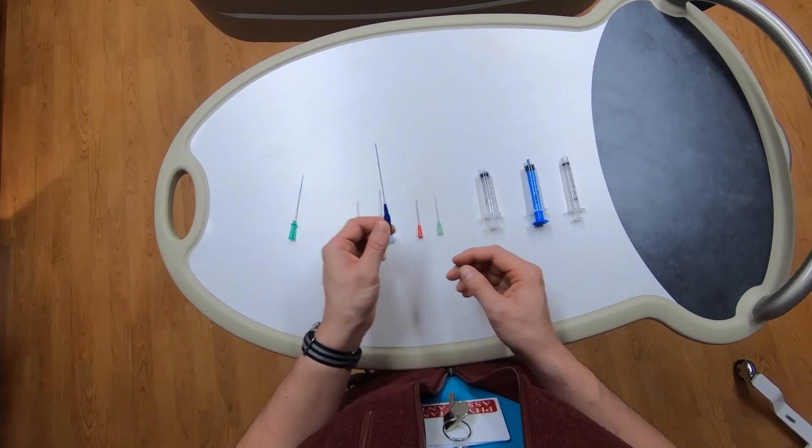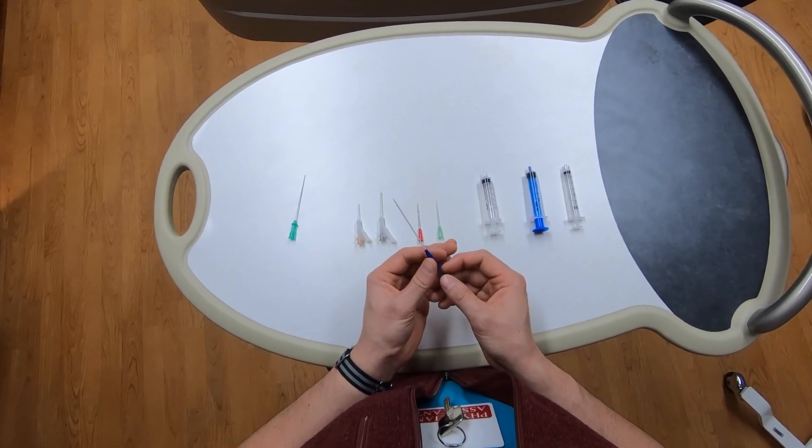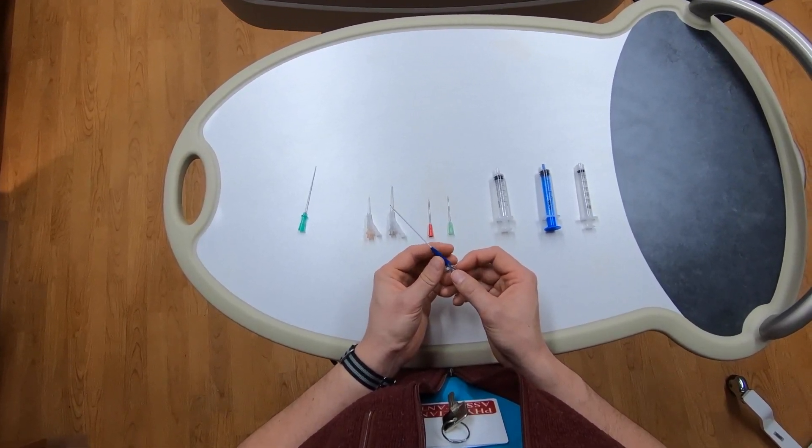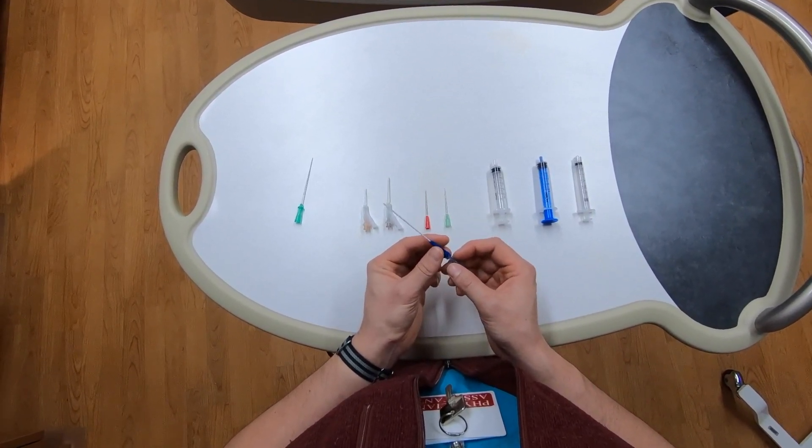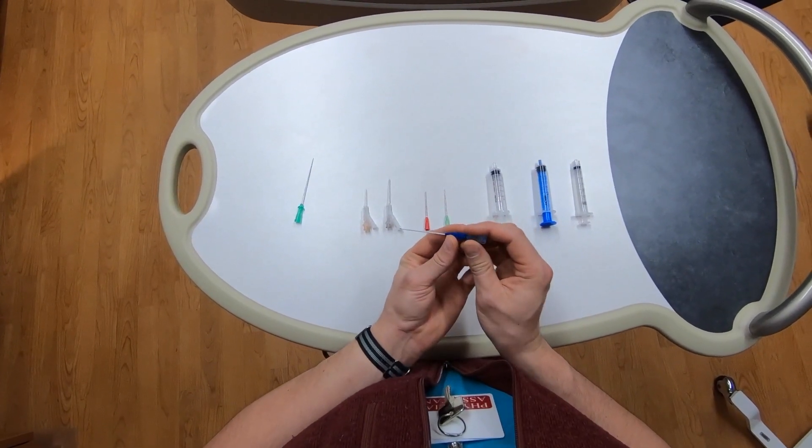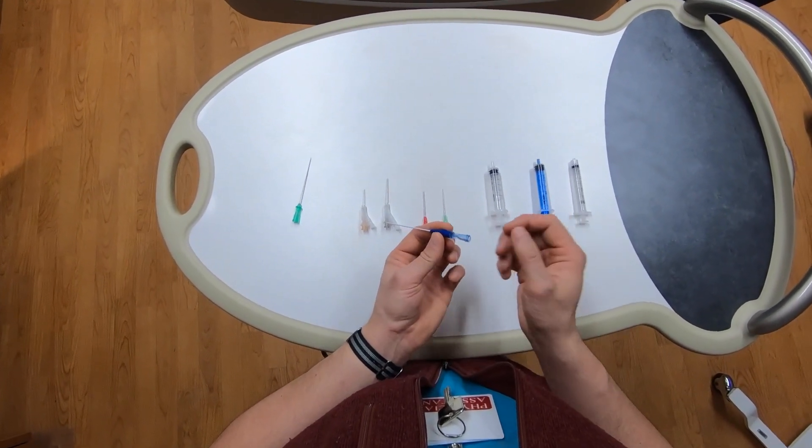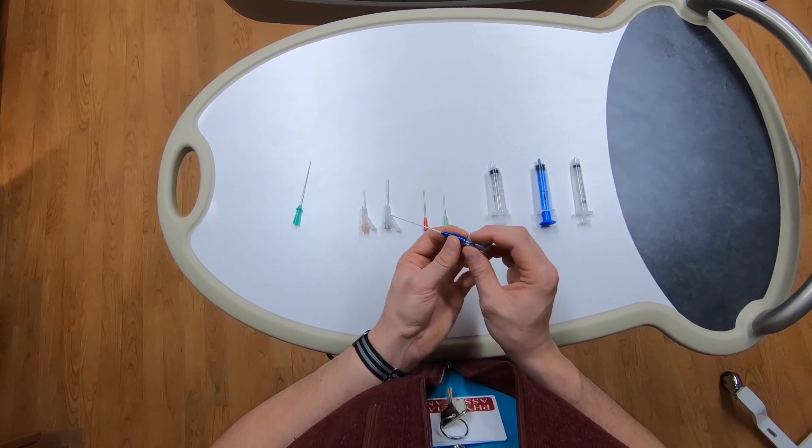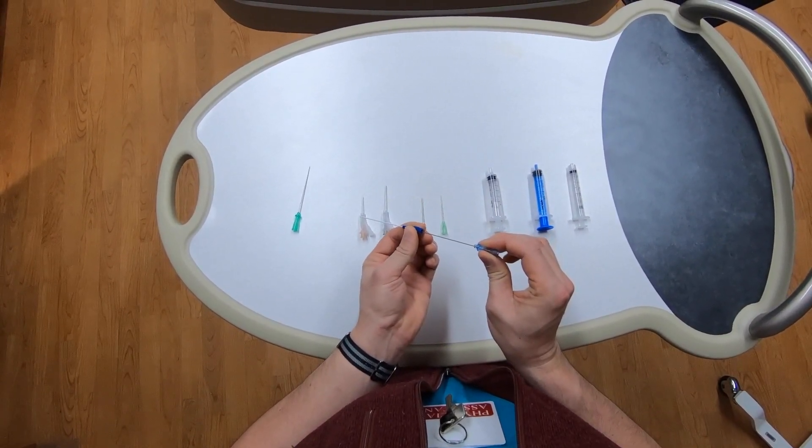Second, you have a catheter over a needle, or angiocath. This is very similar, however, it's used for a somewhat different technique. With this technique, you're going to enter the vessel, and rather than removing your syringe and passing your wire, you're going to advance this catheter into the vessel, just like placing an IV.